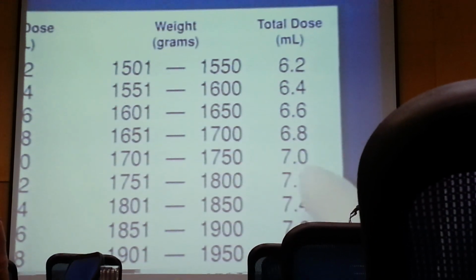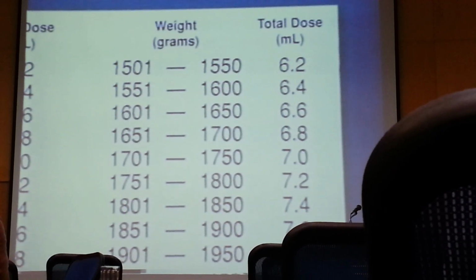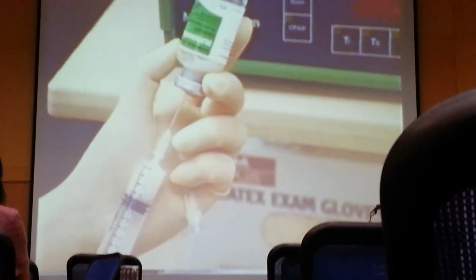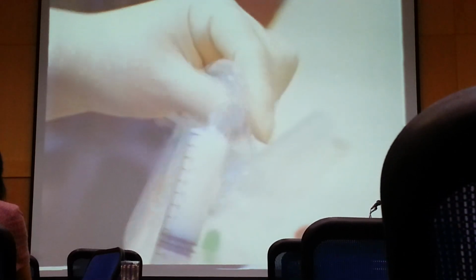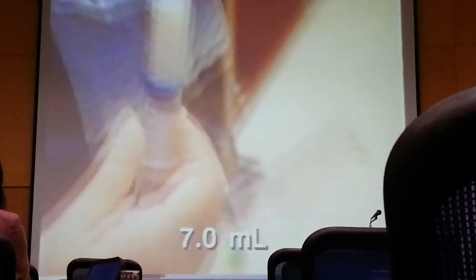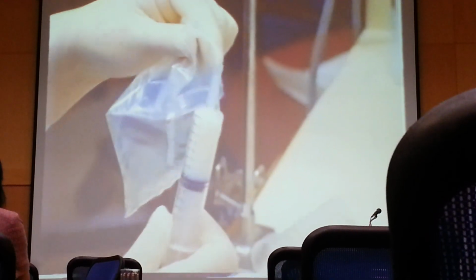Dosage is again based on birth weight. It is not necessary to re-weigh the infant. Fill the syringe with Surfactant. Attach the modified catheter and prime it. Leave only the full dosage in the syringe.